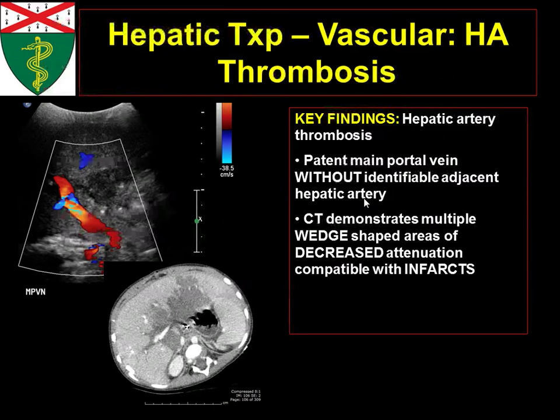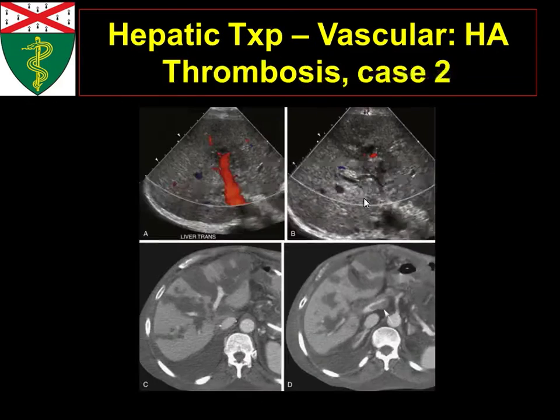They start to stricture, they start to dilate over a period of time, they can have bile leaks, you can have abscesses. And so when Cheyenne took that case earlier and saw an abscess, that's why you have to worry about the hepatic artery, because yes, that could be another hematogenous source, but it could also be the hepatic artery. So whether it's stenosed or thrombosed, it can give rise to biliary problems.